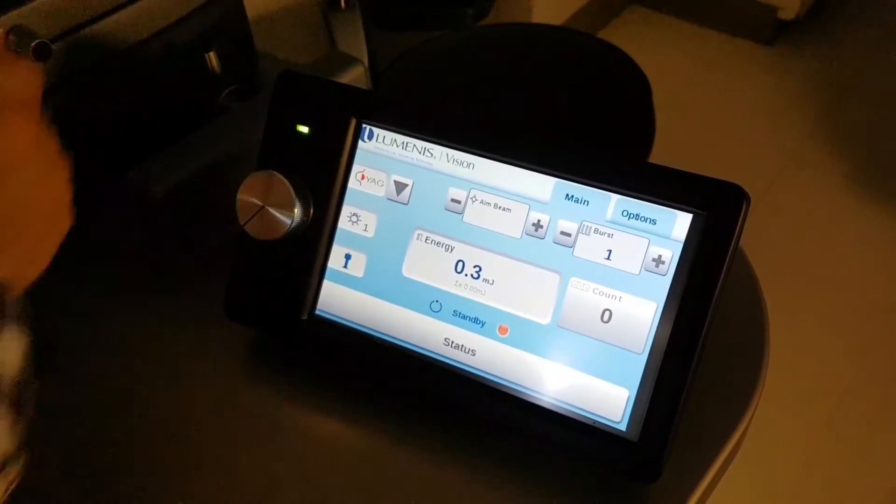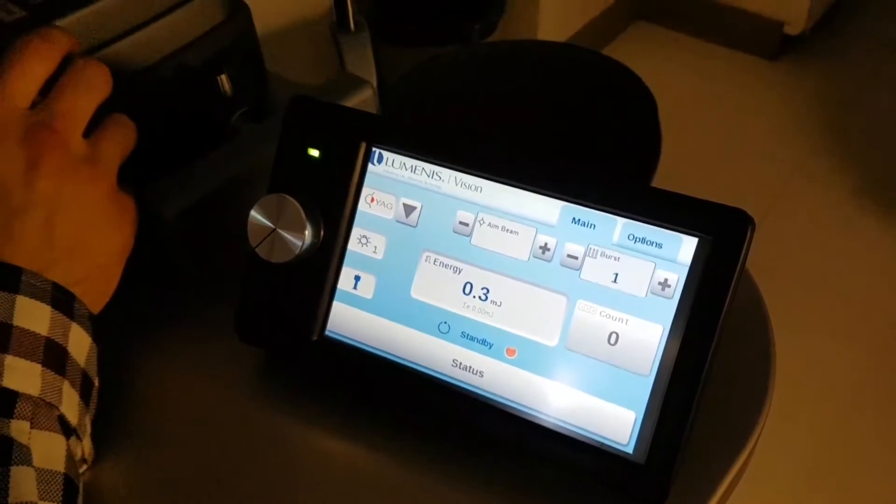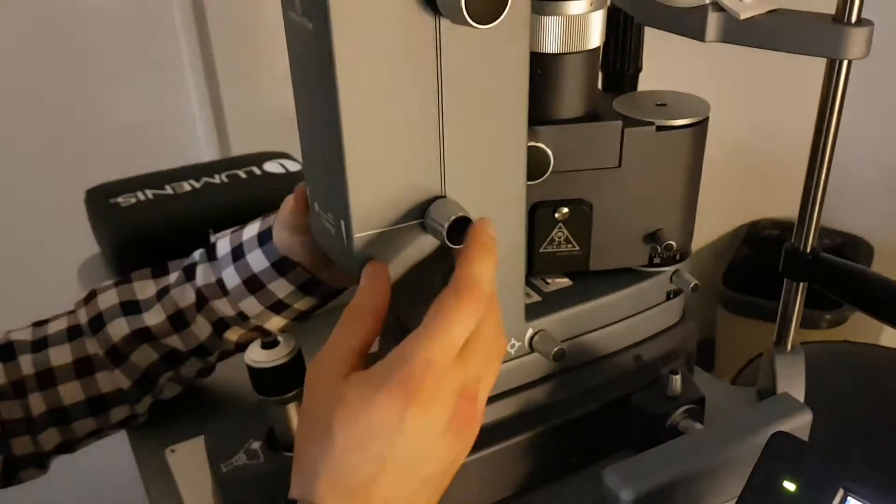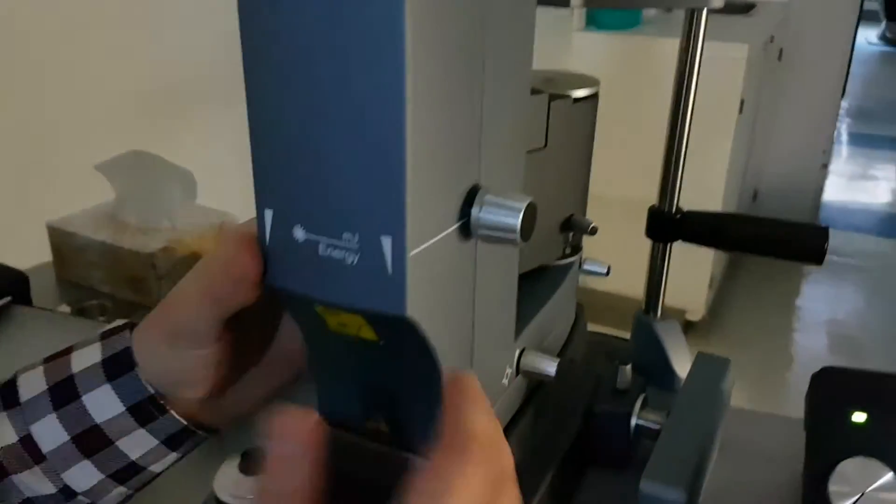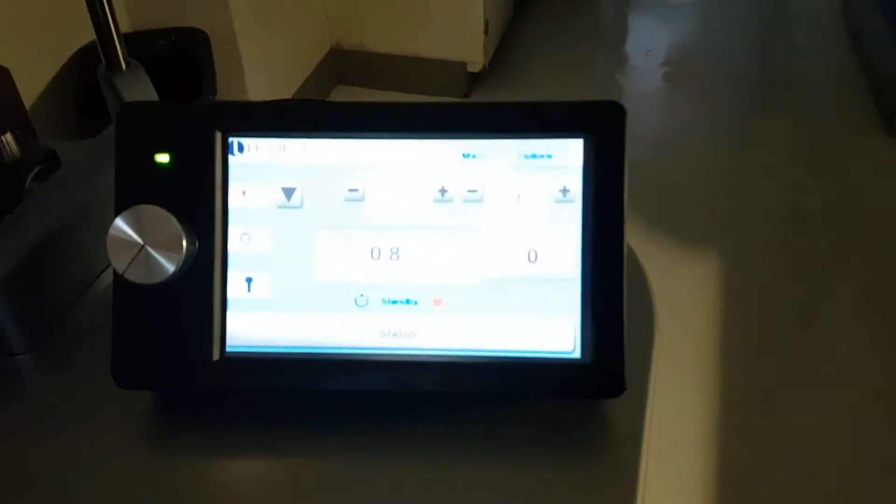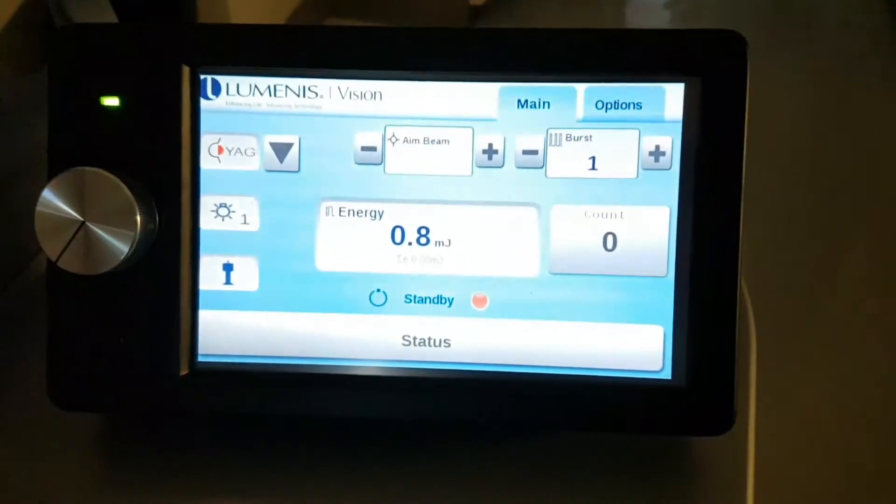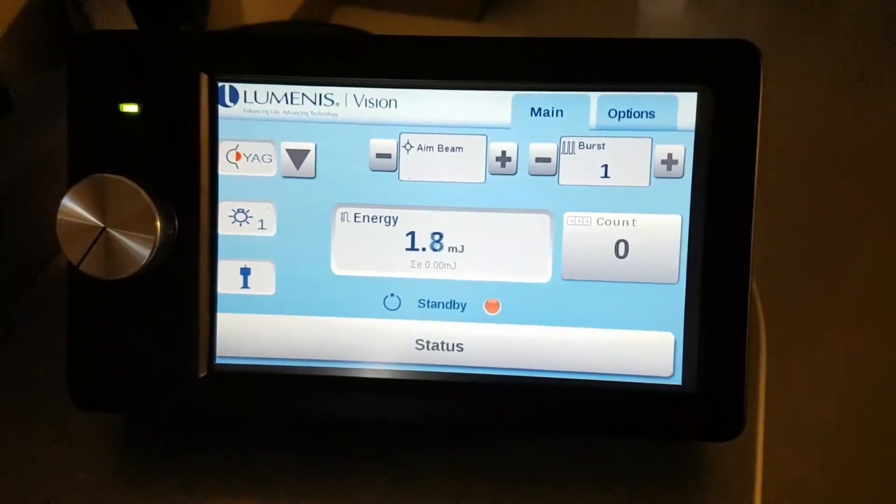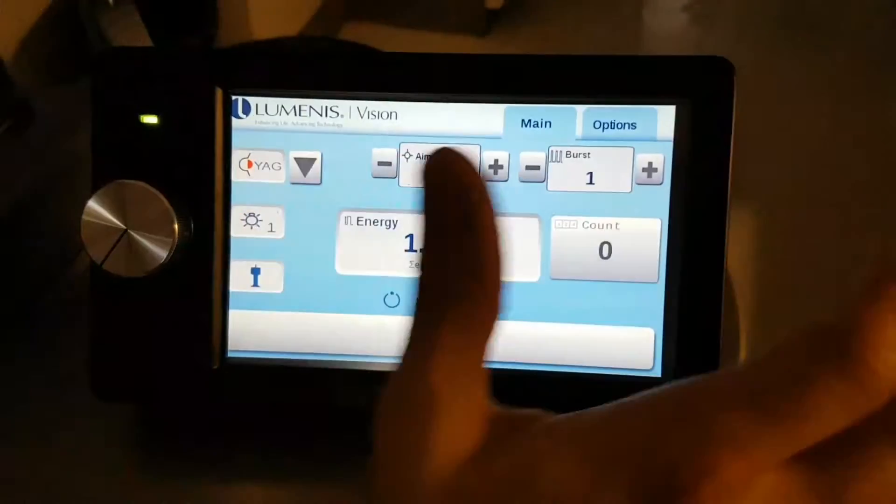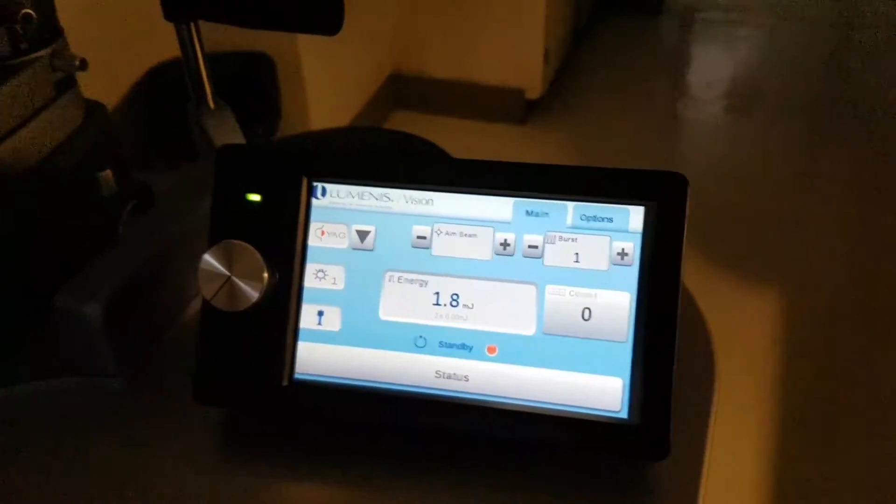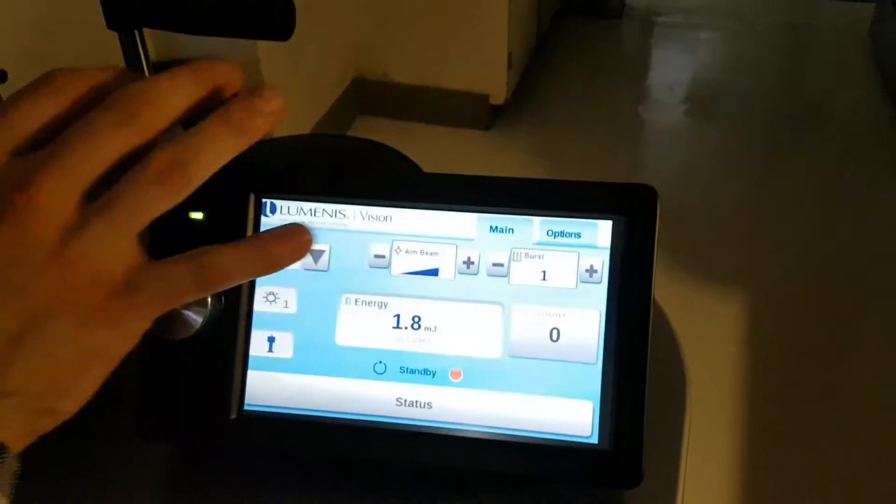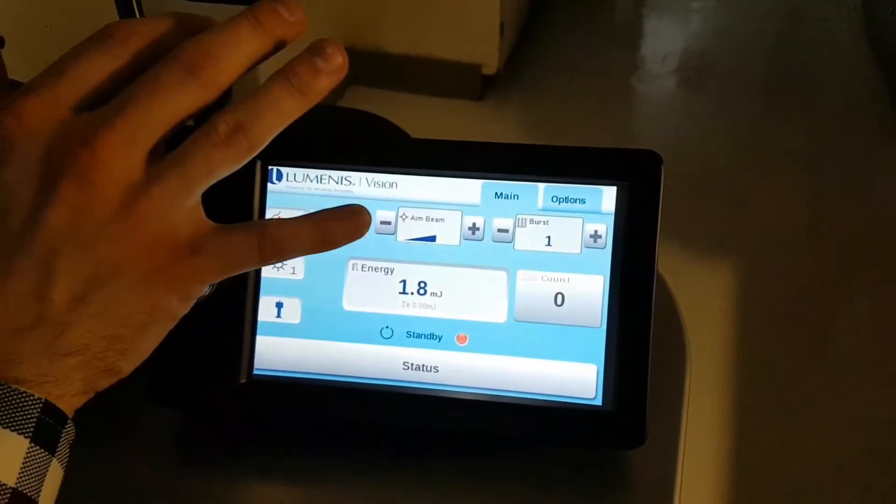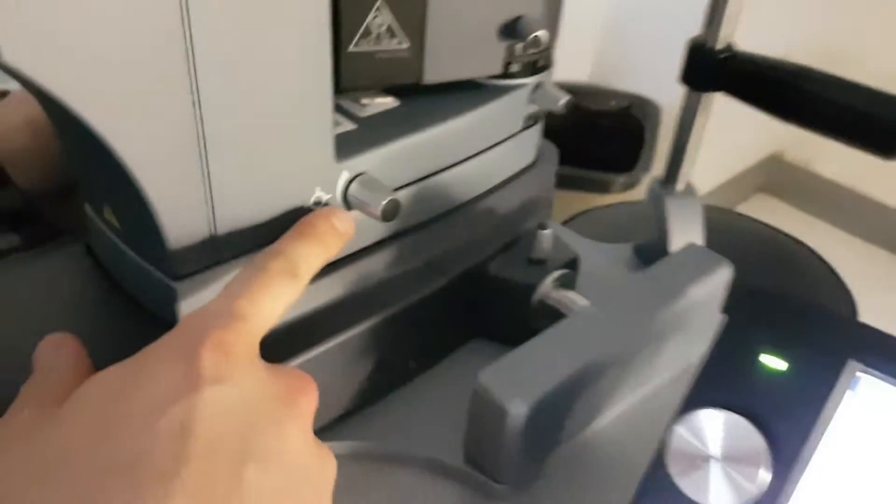The main function that you're going to be changing is the power. It's the knob right here. You can see energy. Usually you won't necessarily play with the touch screen here. Everything that you're using is the knob right there.